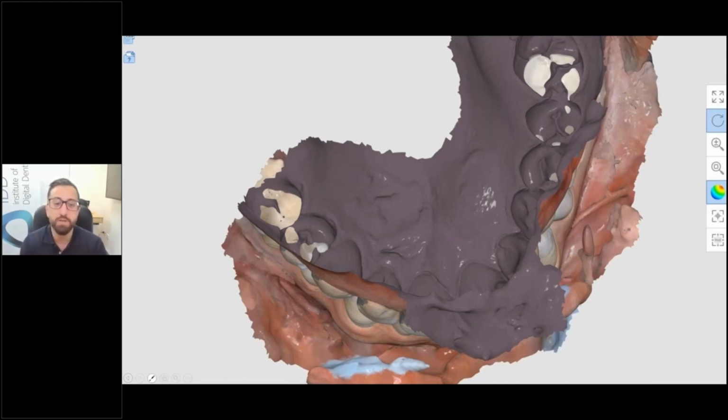So after you've taken your scan, you need to look, you need to check it, make sure it's accurate, make sure it's correct. The lab will pick up a lot of this slack, but this is why labs complain a lot of the time about dentists scanning. It's because of issues like this. So always just keep mindful of that. Rotate the scanner and look where you're scanning and look at the bite registration. Check that there's not too much show through.